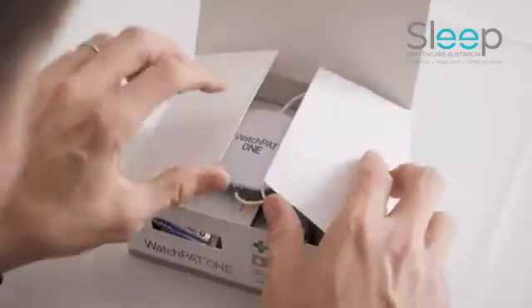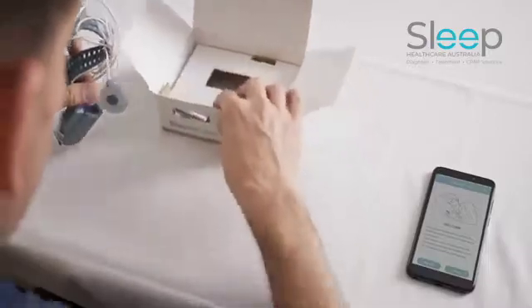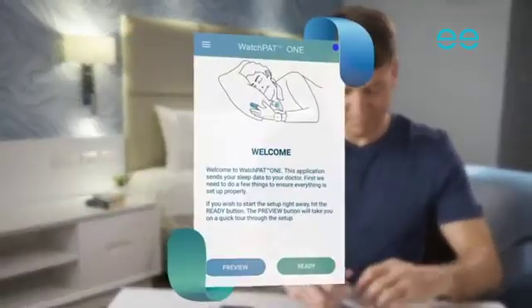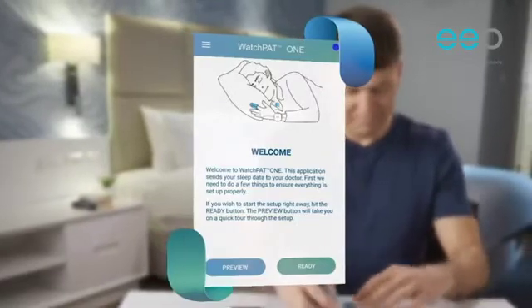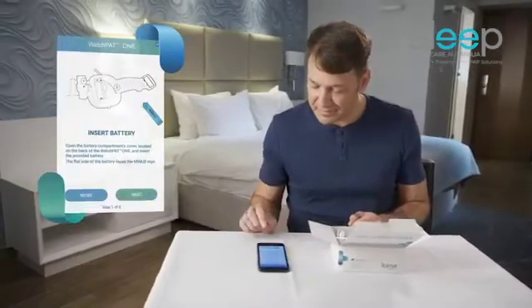Open the box and take out the Watchpat device. Pressing the preview button on the welcome screen of the app will take you through a short tour about how to set up the device. When you are ready, press the ready button.